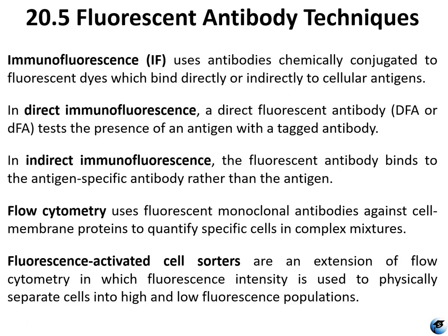In your immunofluorescence assays, this uses antibodies that are conjugated to fluorescent dyes. So we have now left the realm of enzymes, and we're looking straight into the world of fluorescent dyes.